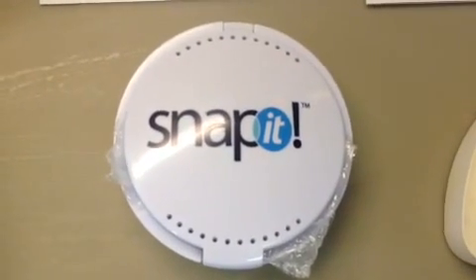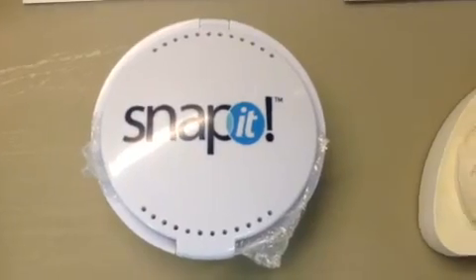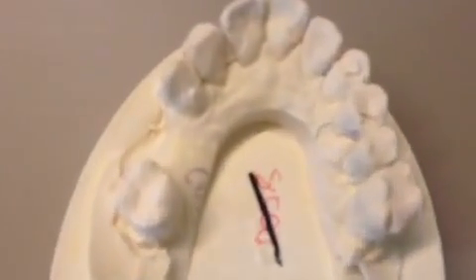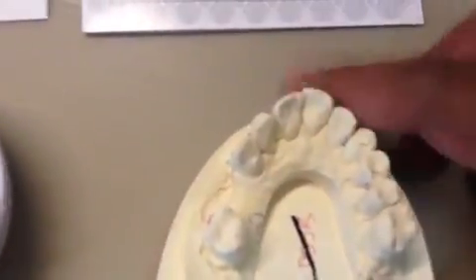Hi, this is Dr. Bazar here from Chafferland Odentsic Care, and we've got a patient who's just had a snap-it fitted, which is a smaller version of a snap-on smile, to replace the gap on the right side. You can see over here on the models that there's a gap between the upper right three and the upper right six.